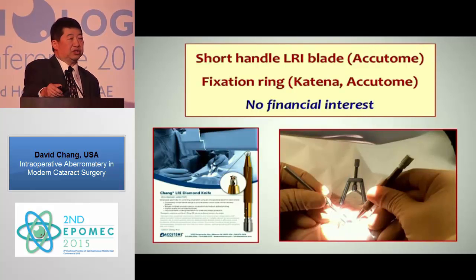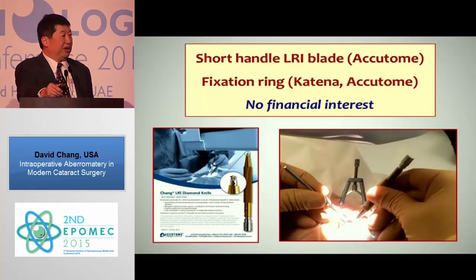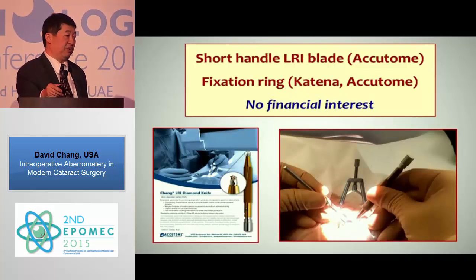Perhaps there'll be questions, but I think this is a really helpful technology, and it's not something I think that you can follow blindly. You're still going to rely on your preoperative diagnostics, pick the lens, go by that. And I think we were talking at the breakfast this morning, where it really helps is it turns out frequently you're just not sure, do I want to do a 20 or a 20.5 restore? Do I want to do a T4 or a T5? Do I want the axis at 165 or 155? And this can serve as a tiebreaker. And that's really when intraoperatively you get that extra reading and it makes a difference.